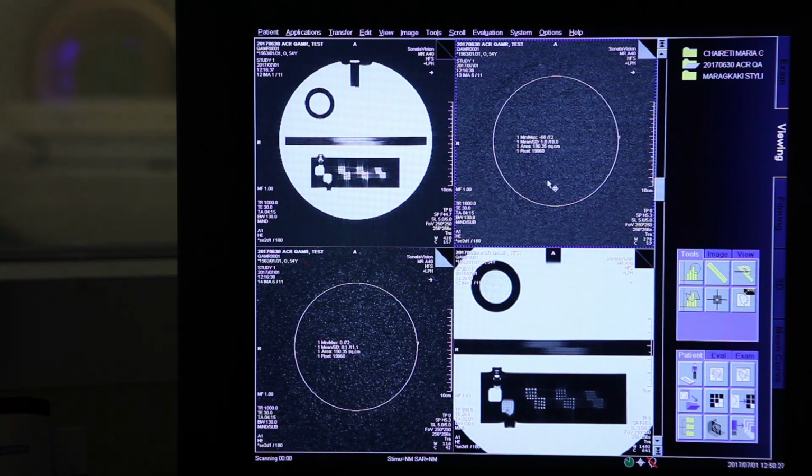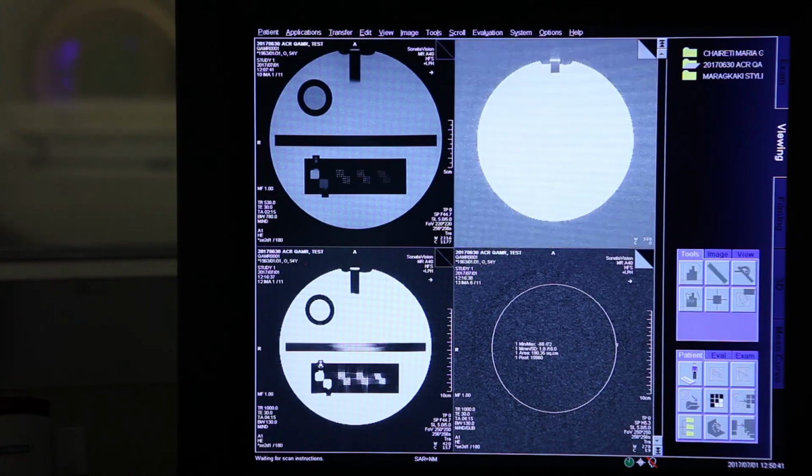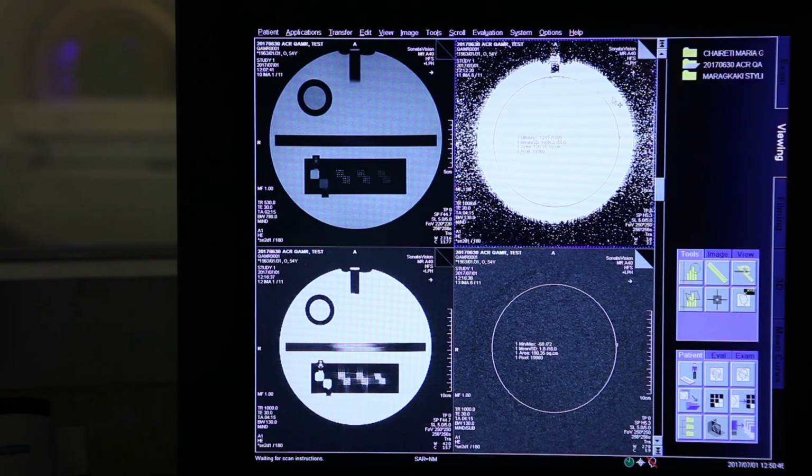The alternative way to do it, and you have what we call the SNR map on the system, is to use the other method, where practically you are measuring noise outside the image. Important to mention here: for pixel-based analysis, you need the second method. You measure the signal in a pixel, and then you take an ROI of the background, which is the estimation of noise from the background of the same image. There you are able to find the SD because the SD is the same for all the pixels.